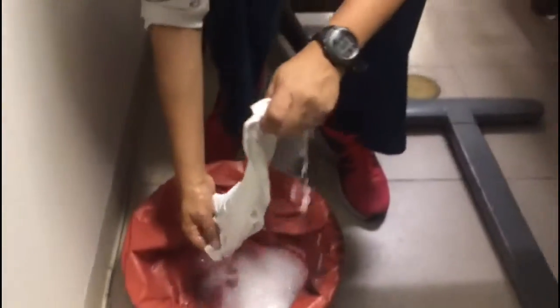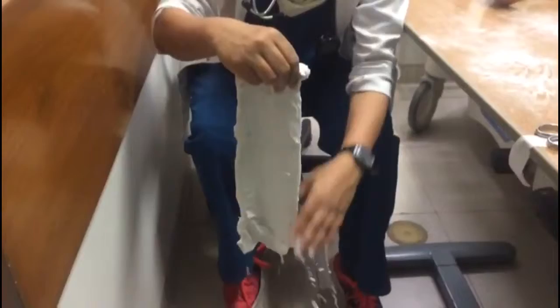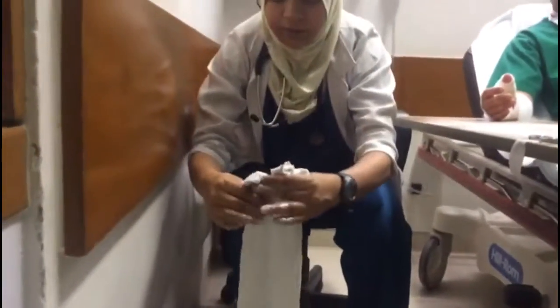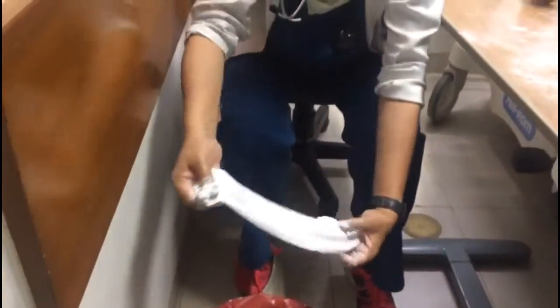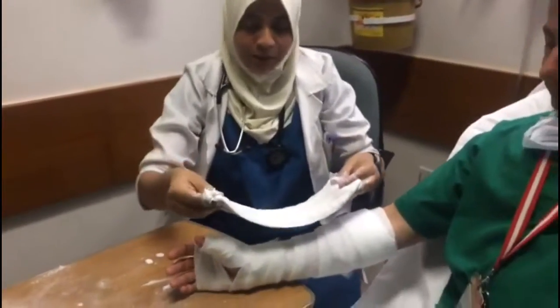Use your fingers to remove excess water, mold the strips together, then use the cut ends to mold it around the thumb. Apply one last round of soft roll. Check that your molding is fine, keeping the thumb in a cup-holding position, and make sure the edges are smooth.